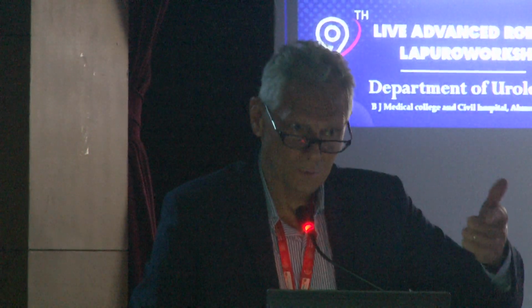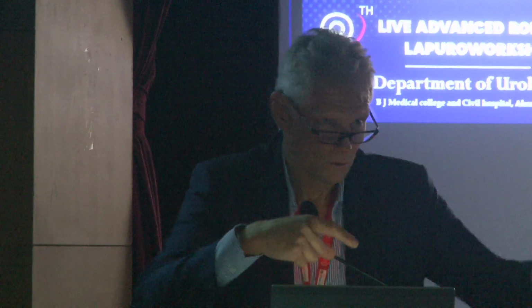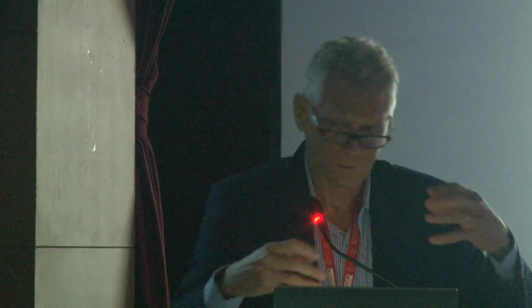So it's a matter of habits. You can do it with several possibilities. You can do it with a balloon, but it's expensive. You can do it with your finger. I've seen some surgeons just opening the muscle, placing their ports, or you can do it with a scope. I learned this technique from a general surgeon 30 years ago. I'm still doing hernia repair, and he showed me this in 1991. So it's easy to do for me, but do it as you prefer, with a finger or with a balloon. But go in this space.